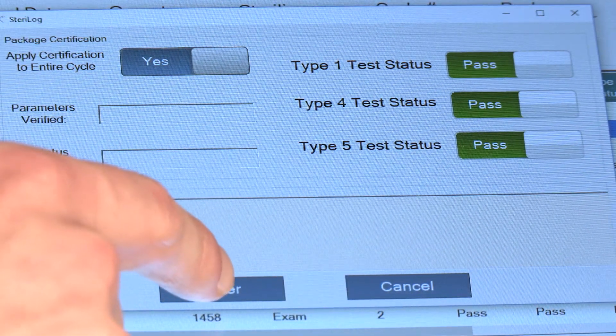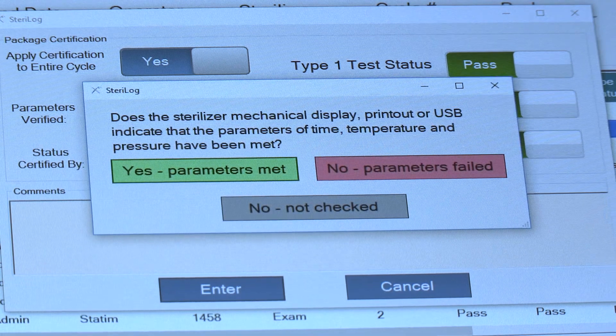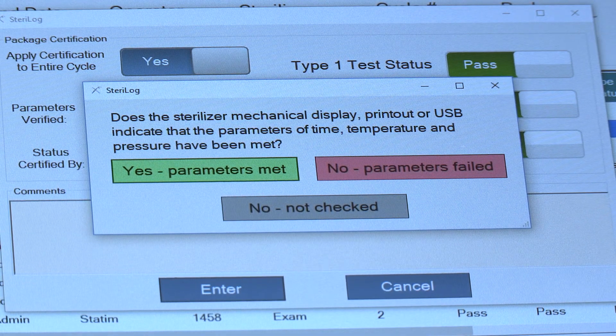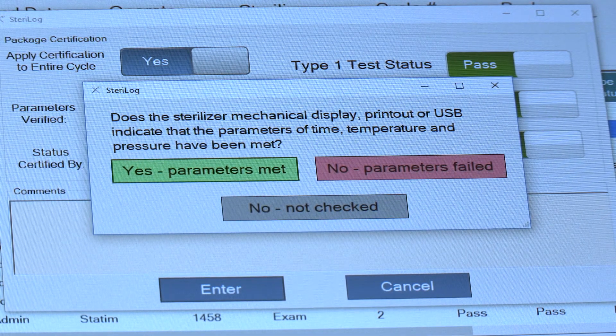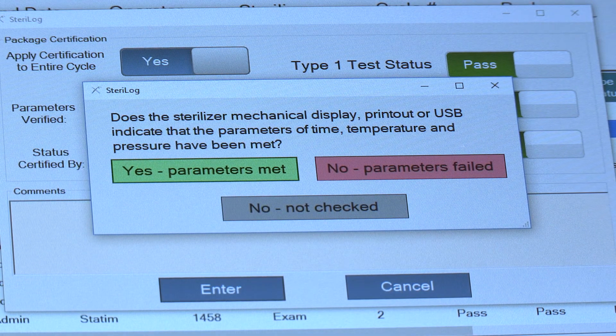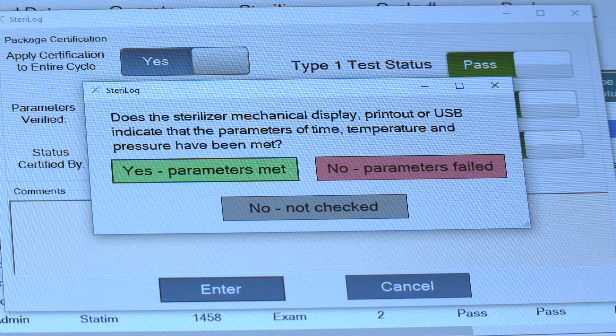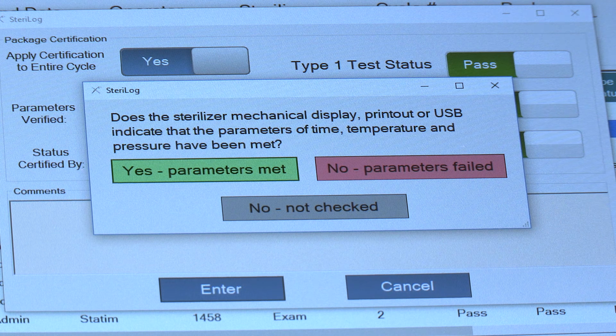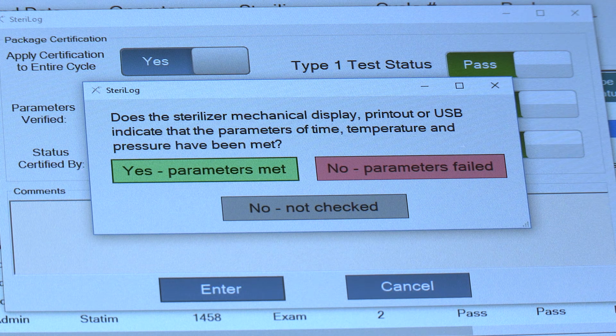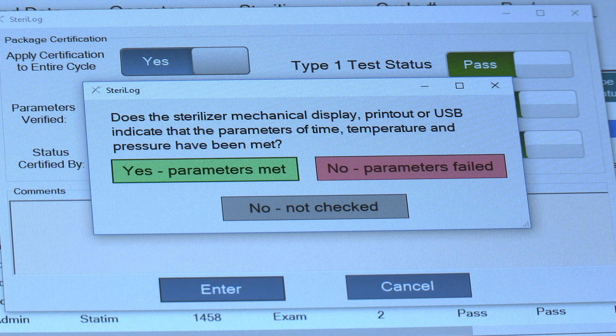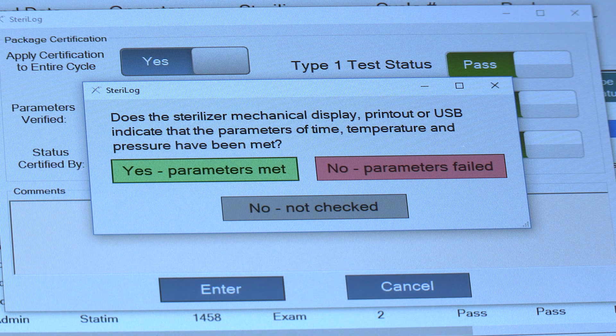You then finally hit Enter and you'll be prompted to verify that the parameters of time, temperature, and pressure of the sterilizer have been met, so either by checking the USB or mechanical display or printout from your sterilizer.